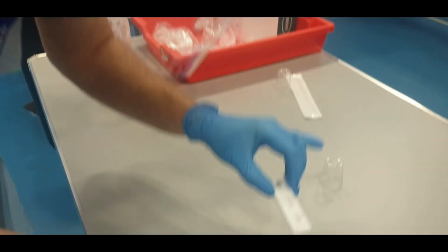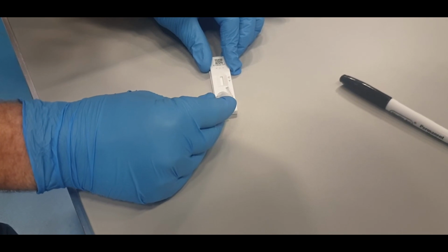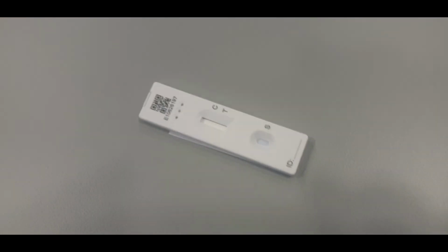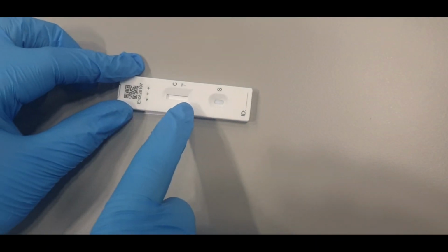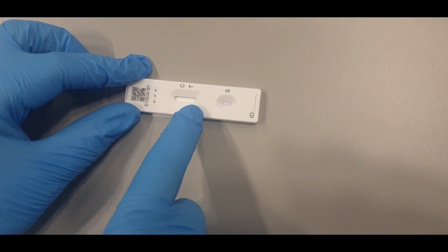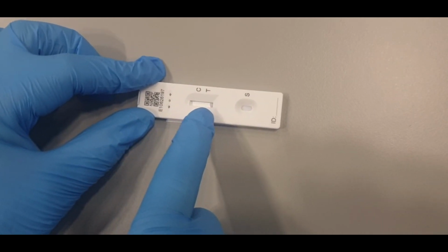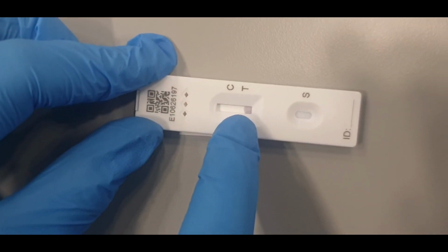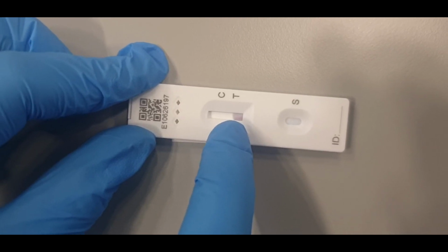Now this is the lateral flow test itself. I'm going to put two drops on here, one, two, and we now get a mixture of antibodies and enzyme moving up the test, and hopefully you should be able to start to see it. There it goes, turning purple as the liquid soaks through. Now, if the COVID antigens have attached to the antibodies, they will stick to some fixed antibodies here in the test window, and they'll give us a band. This will take about half an hour to happen.